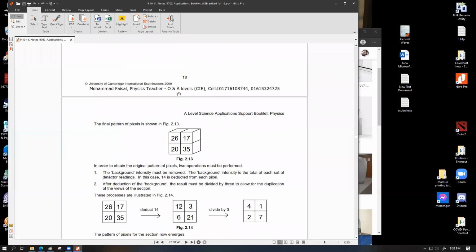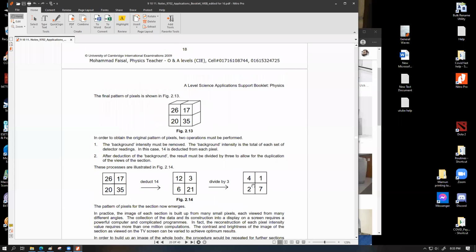How does this help us to do that diagnosis? The idea is very simple. We know how a typical or healthy person is supposed to have those values aligned in a certain location of their body. The way the computer works is that we are basically getting the pixel values for 4 different voxels for one orientation, and then we can have this for multiple.